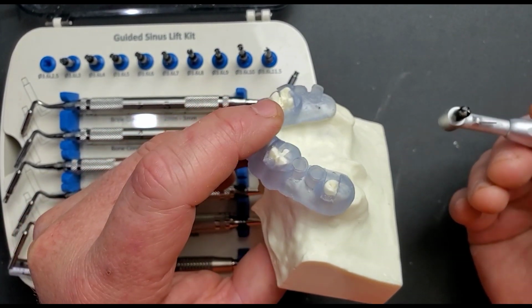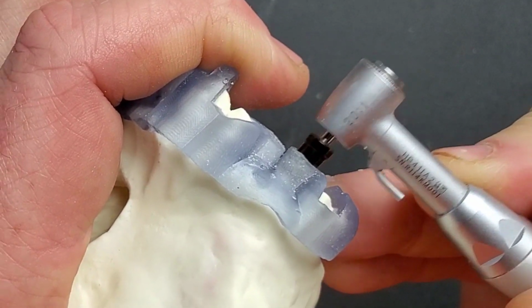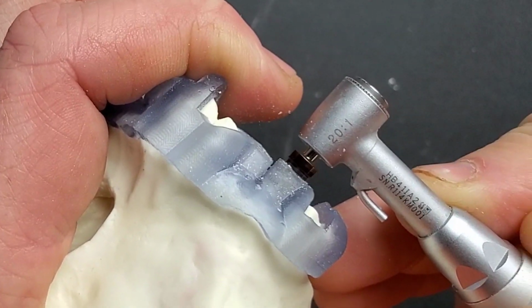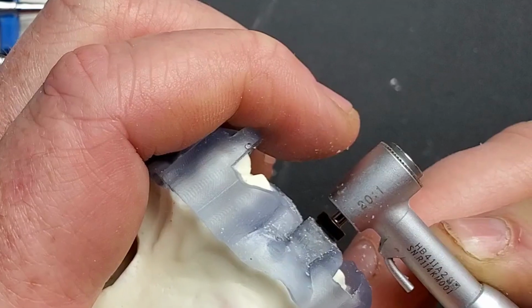And we're going to take the initial burr and we're going to go in through our guide, and going up and down, we're going to just peck away at it. With any kind of guided drill, don't ever just get in there and just let it spin for a long time. That's a good way to generate heat and cause some problems for the patient. You end up getting bone dieback.